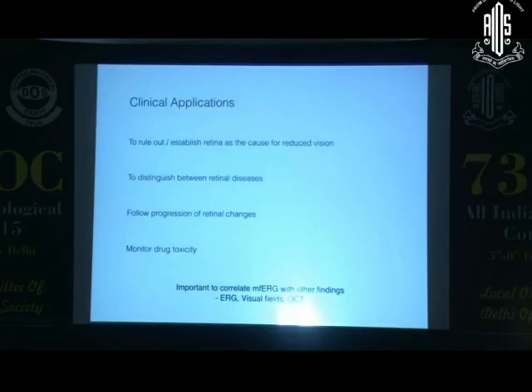So where do we use multifocal ERGs? Most of the time when you're using multifocal ERGs, the full field ERGs are usually normal in these patients. You still don't know what the cause for the visual loss is, and you want to know. Now you need to know whether the visual loss is because of a retinal problem or an optic nerve problem. This is a useful test. This gives you any problems in the photoreceptors up to the bipolar cells, it will tell you there's a problem. Ganglion cell abnormalities will not; you will get a normal ERG here, normal multifocal ERG.